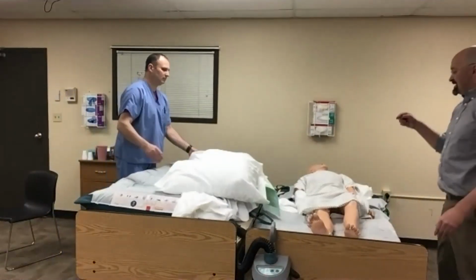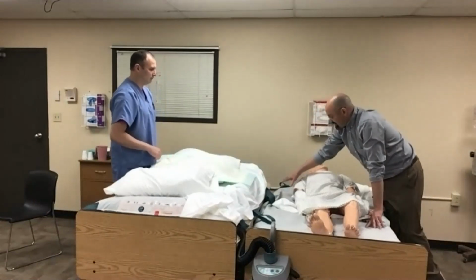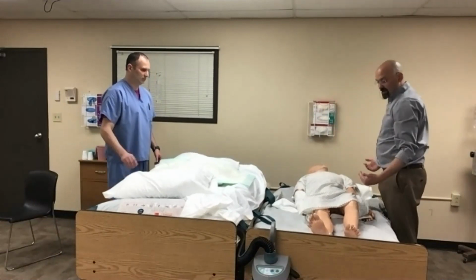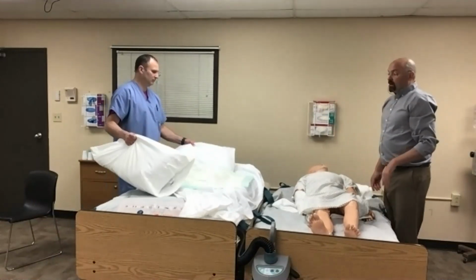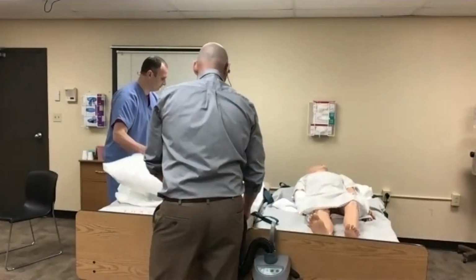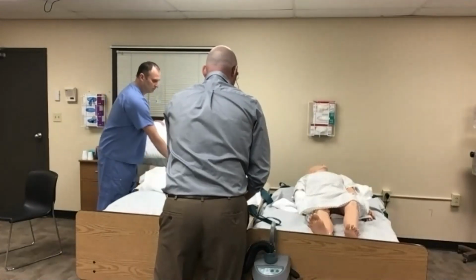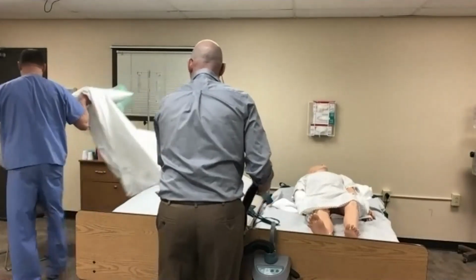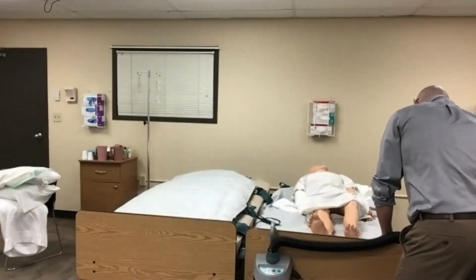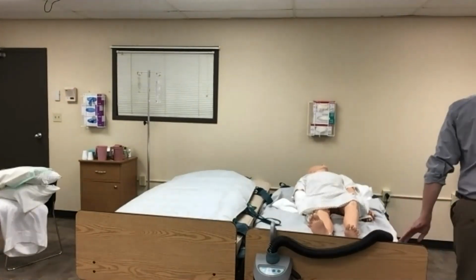When I'm on this side, what I try to make sure is that the shoulder ends up right square on this part of the mat, so he ends up centered on this surface. What we're going to show you quickly is what this looks like with a real person. So even though there's 2 of us, Mark is going to prone me back on, to leave the pillows or not. He's going to prone me right back onto this surface, and we're going to have Drew here slide off.